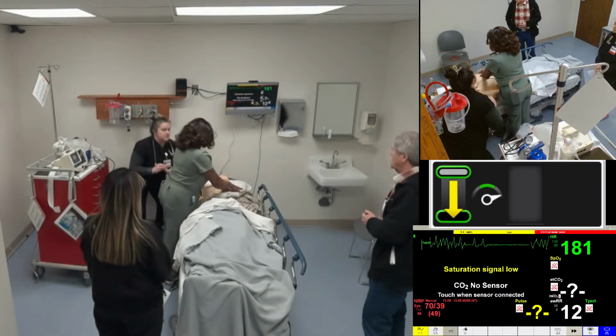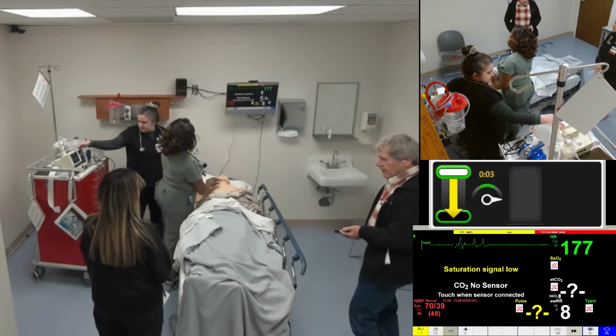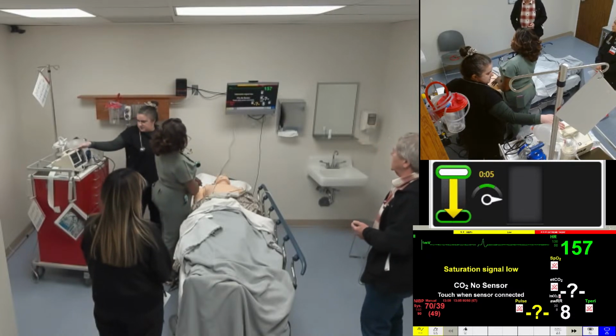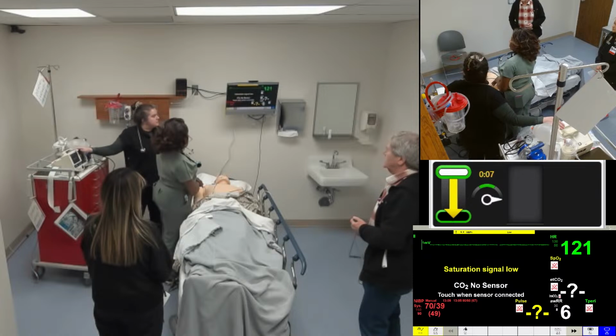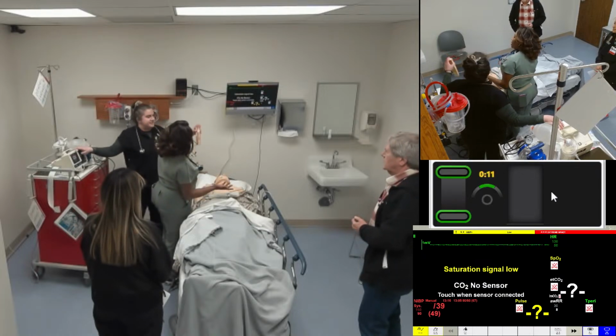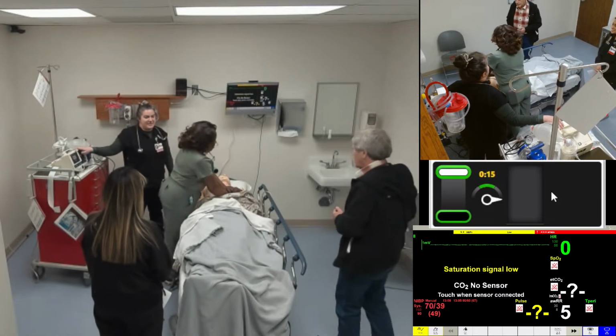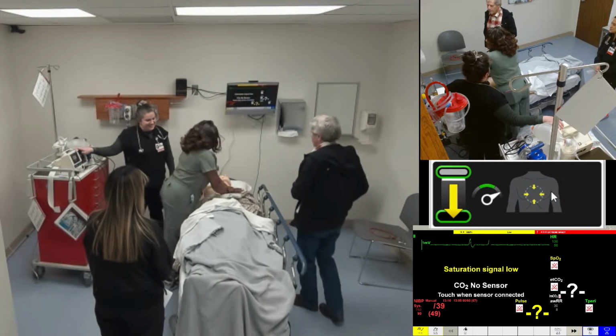Alright, do you wanna analyze your rhythm? Analyzing. So now you've circulated for 2 minutes. Alright, now what do you got? No shock advised. What is this rhythm? He's just asystole. Good, perfect. So what are we doing with an asystole? CPR, yes, continue CPR, good.